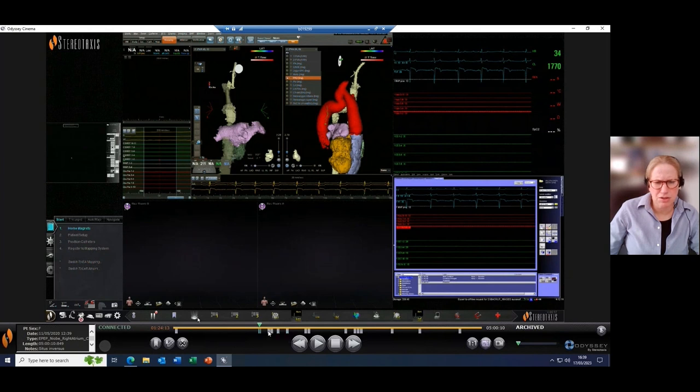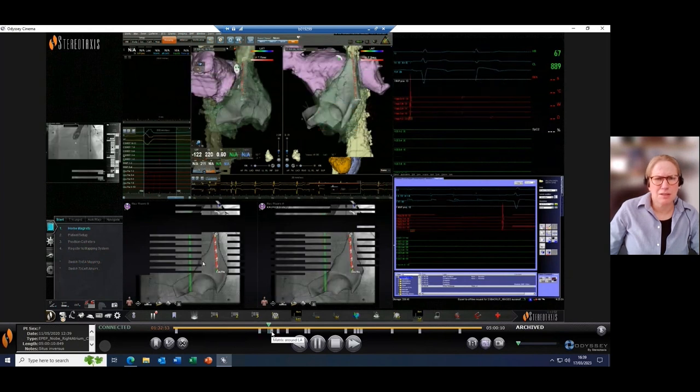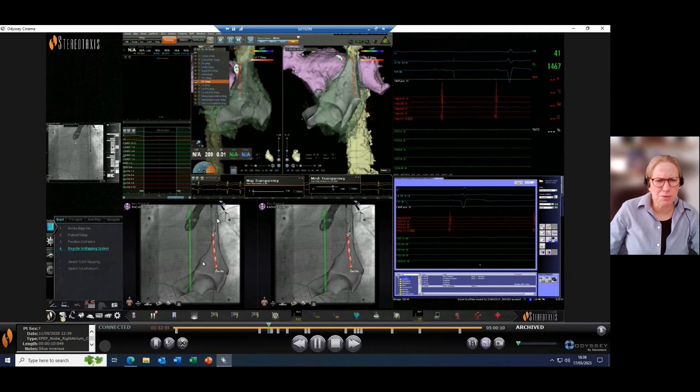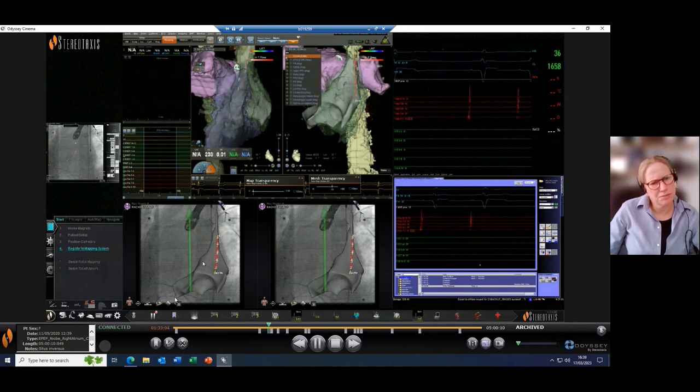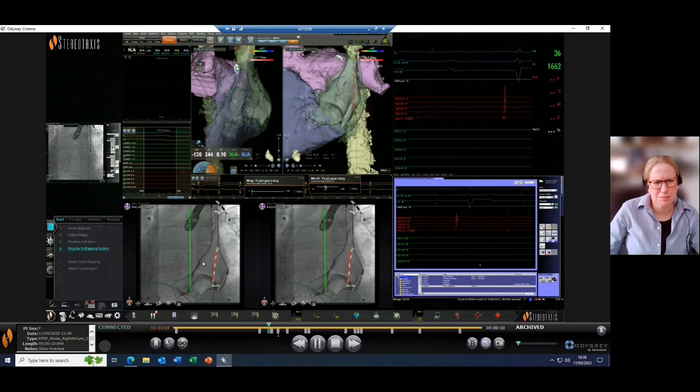And I'm just going to jump forward and show you again how we did this in the transjugular approach procedure. So here we see a Decanav catheter that was used to create a matrix. And the nice thing here is you have the picture-in-picture display on the CARTO RMT system. So that was nice. You can create the anatomy, you can merge adequately, you can orient yourself better on your X-ray reference pictures.